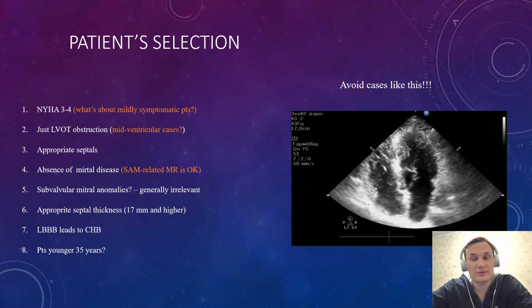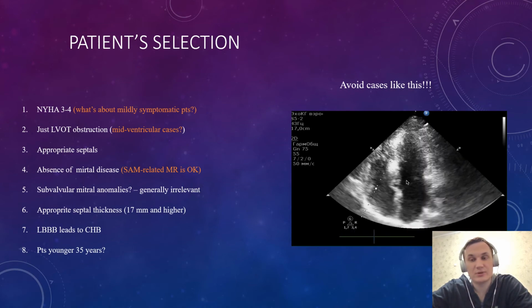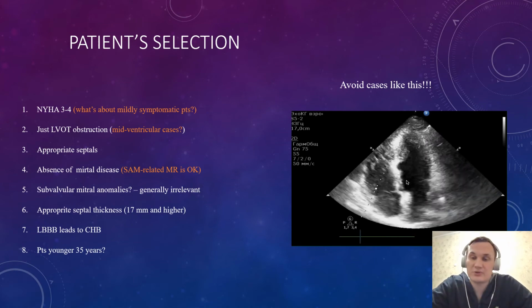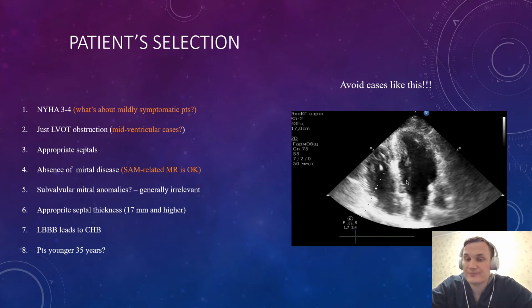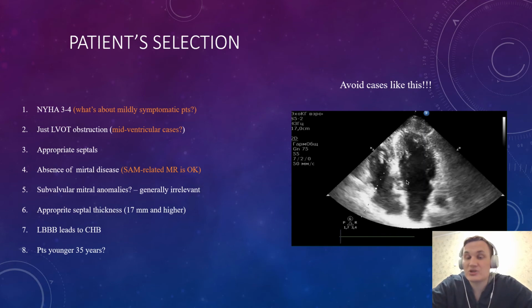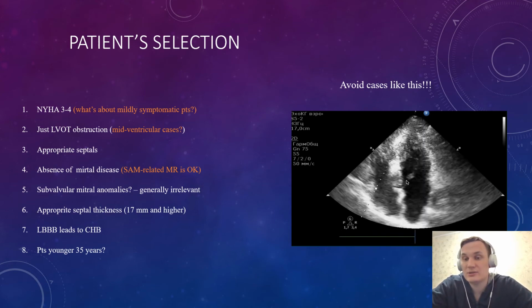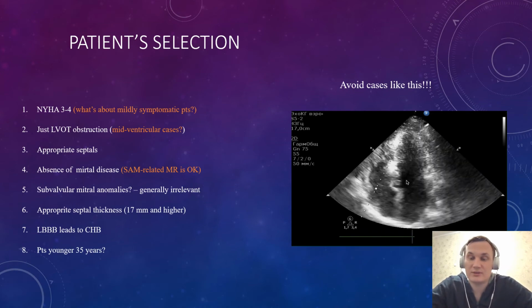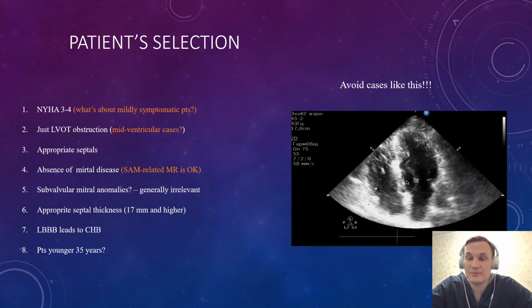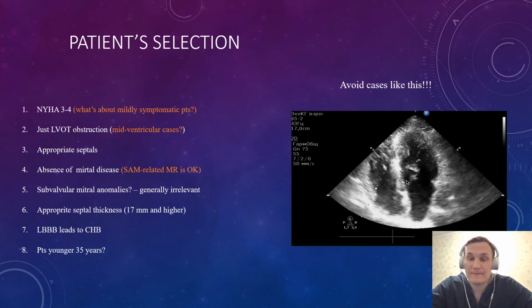LBBB, left bundle branch block. Of course, we should discuss with the patient if preoperatively we observed LBBB, and we should discuss with patients that ablation generally leads to RBBB, I mean right bundle branch block, and in this instance it can lead to complete heart block and pacemaker implantation.